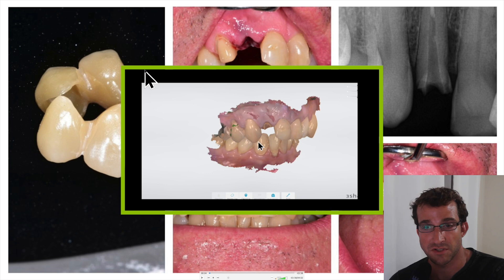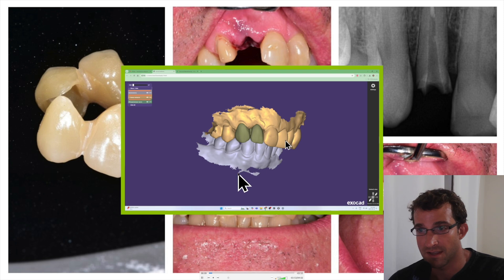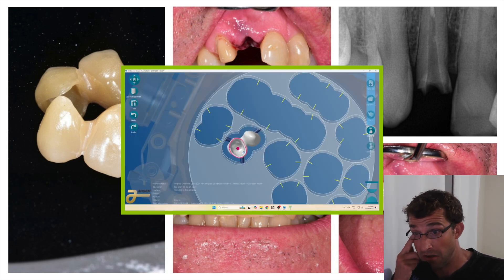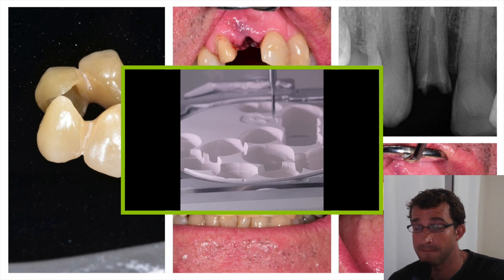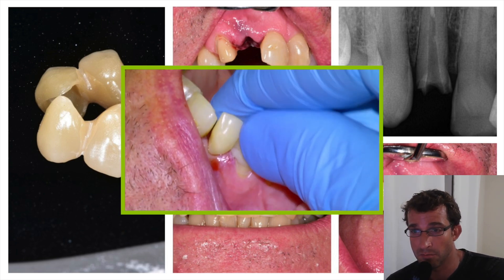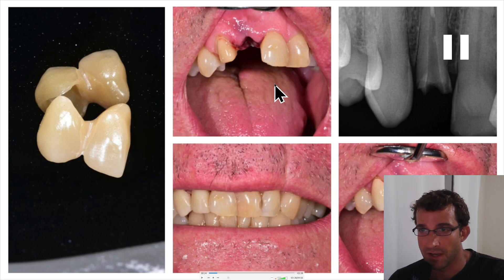You could also do a conventional bridge where you have to cut away the central and the canine. Or you could do a Maryland bridge, which was one of the options we were closely considering. But in the end, we decided to do a 1-3 cantilever 1-2 pontic. So we'll go over that in this video. Here's some footage of the case — this is the CAD design — and then we're going to go over the manufacturing.